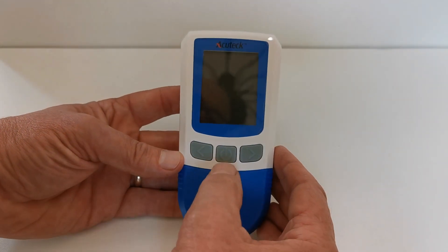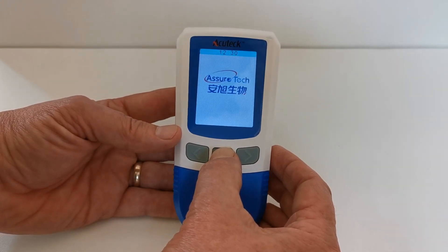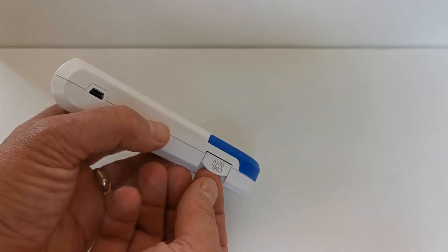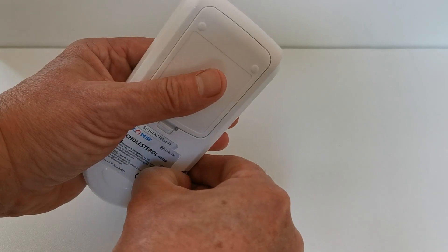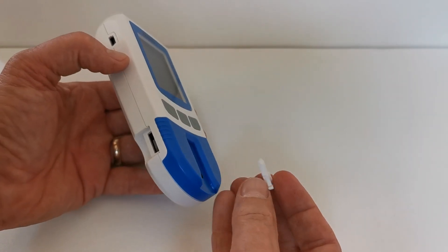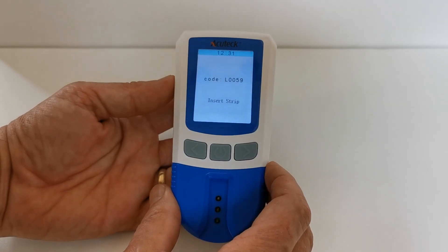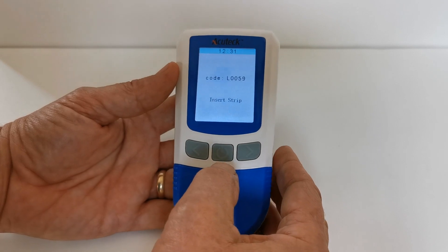Turn the meter over and hold and depress the power-on button for one second. It will show you the code chip that I've inserted into the side port here — that's the port for the code chip that comes with the meter and strips, and it goes in firmly by pushing it in. The meter is now ready to run its first test.